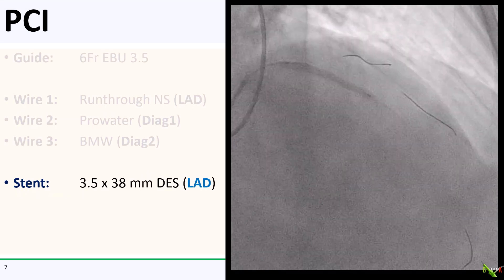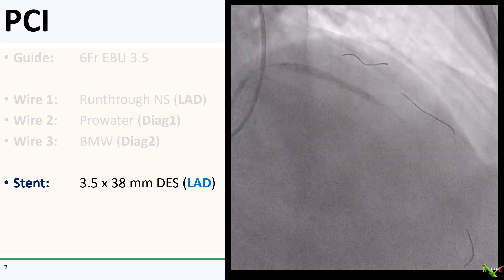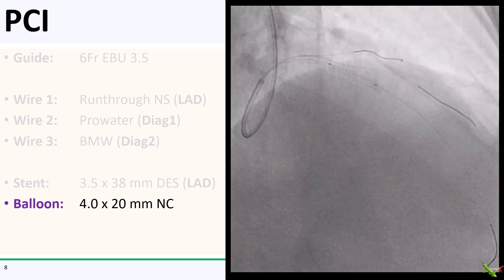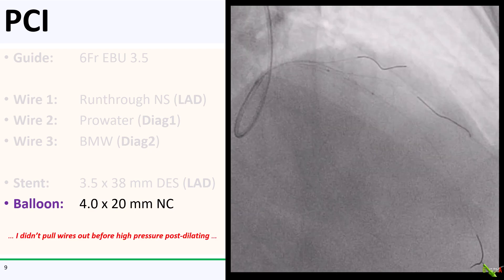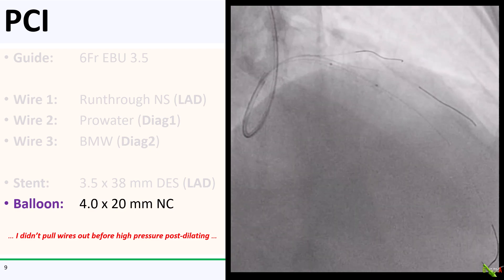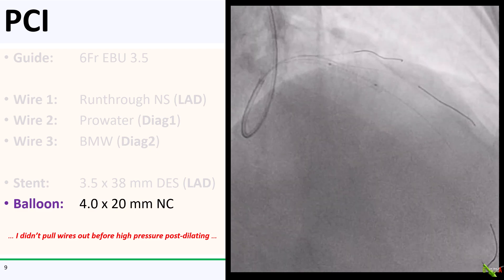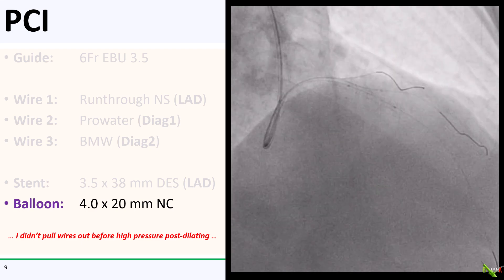Here is a 3.5 by 38 millimeter DES going into the proximal to mid-LAD. I then post-dilated the stent with a 4.0 by 20 millimeter NC balloon at high pressure. Notice that I inadvertently skipped a step — I usually remove my side branch wires before doing high pressure post-dilation, and I did not do that here. Generally it's not a problem, but this time we got into trouble.